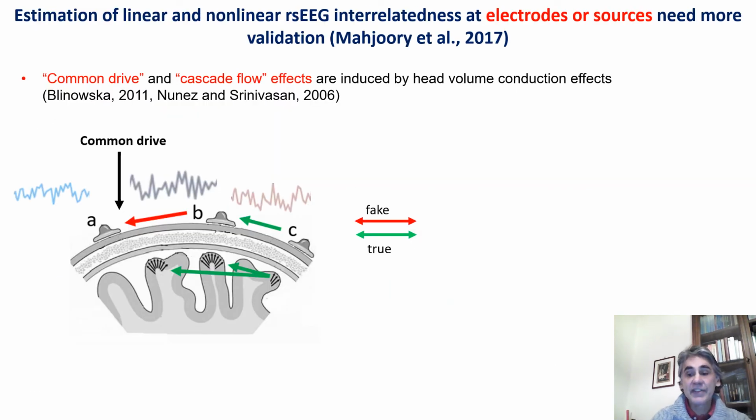However, synchronization likelihood and other techniques are affected by head volume conduction effects. In this slide, you can see, for example, the common drive effect.